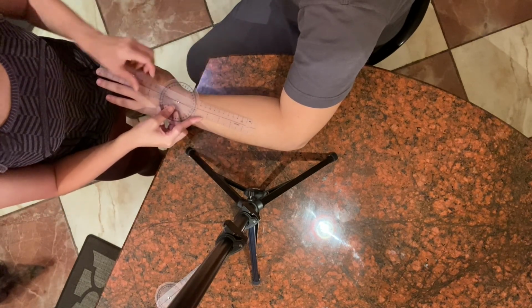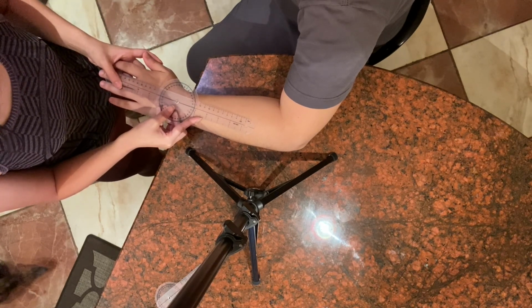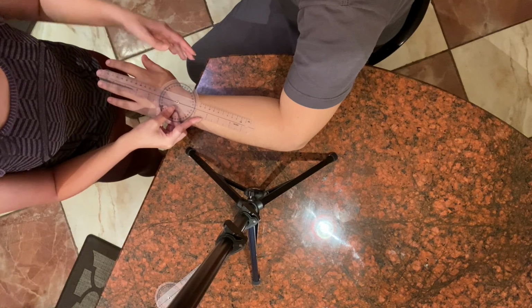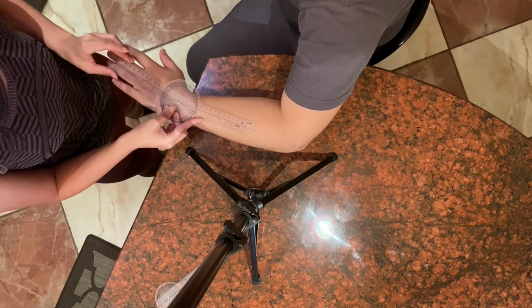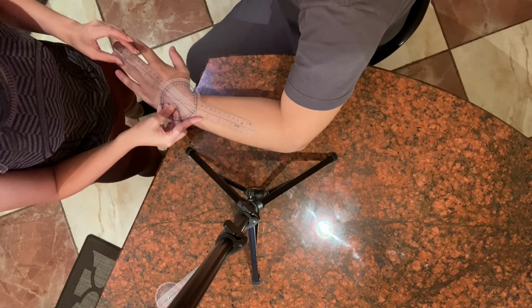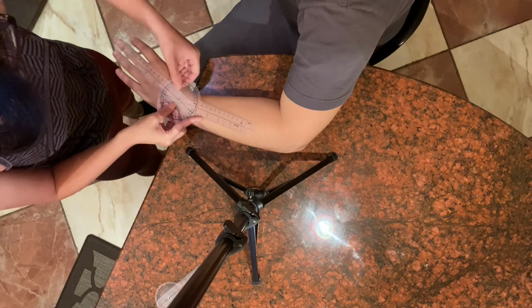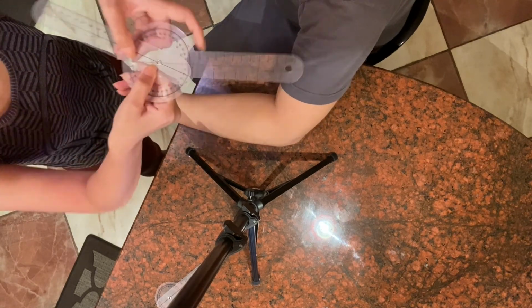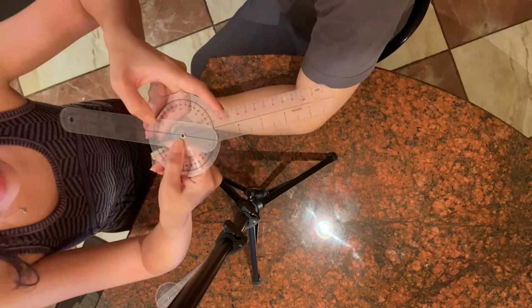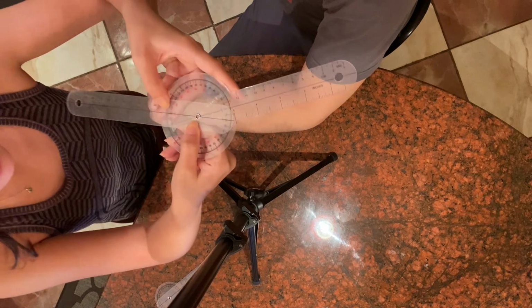Now I'm going to ask the subject to position and move his hand towards his body. Okay. And we're starting from 180, and it ends at about 160, so that reads at 20 degrees.